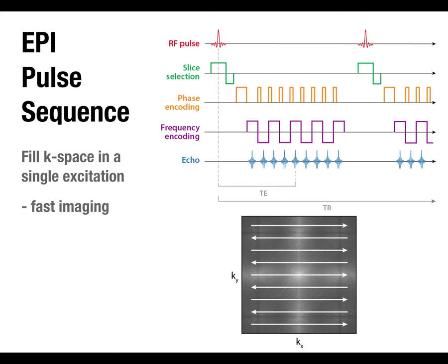So practically what's happening is rather than turn on a gradient for a while and then read it out, you're rapidly switching these gradients in different directions. And that was actually the part that was difficult engineering-wise. It turns out to be quite challenging from an engineering perspective to create these gradients and then reverse them and flip them very quickly. It also creates some other issues.